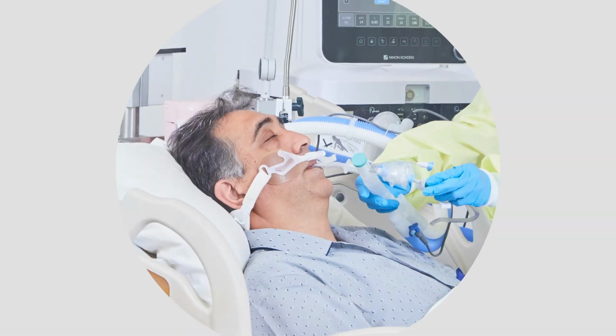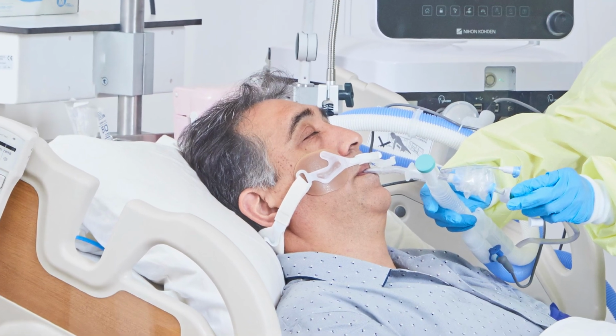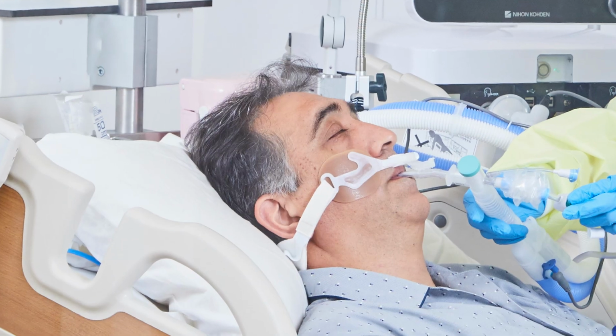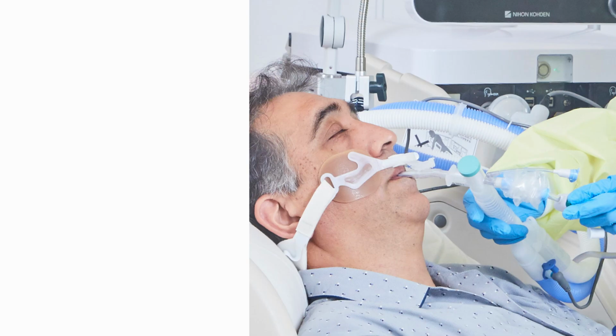While suctioning an artificial airway is a common procedure, it often causes desaturation, secondary to loss of lung volume from the procedure. To prevent patient decompensation from inline suctioning, many ventilators offer O2 enrichment before, during, and after these procedures. FiO2 enrichment may help to prevent desaturation. However, it does not address the root cause of open lung units collapsing from the suctioning procedure.